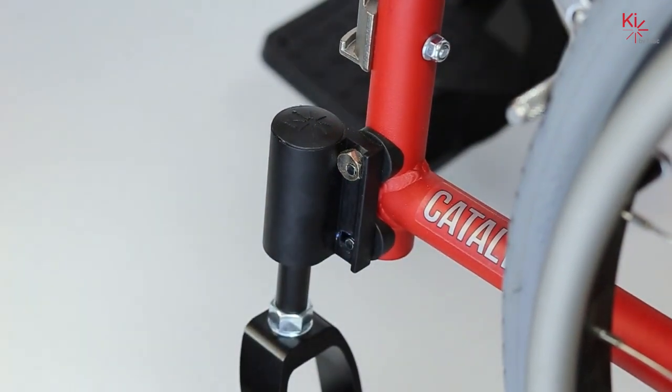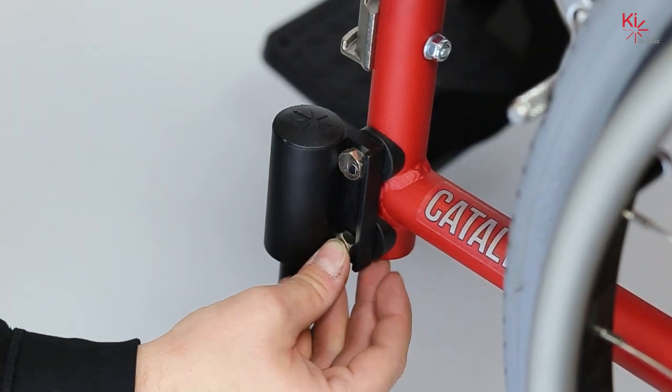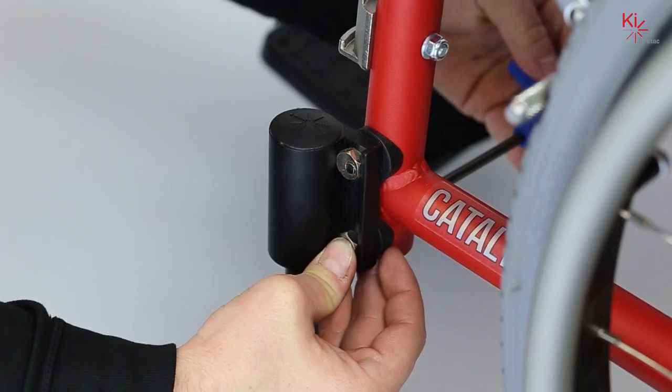Now referring to our reference chart, we know that we need to rotate our eccentric nut counterclockwise to the next flat surface, and then re-secure the system using the five millimeter Allen key again.